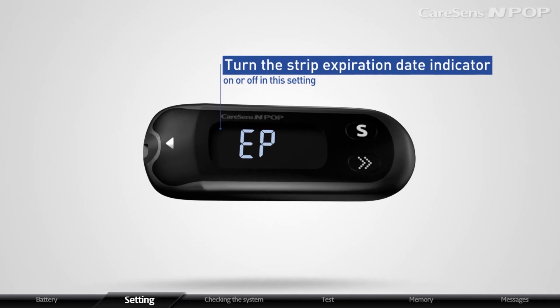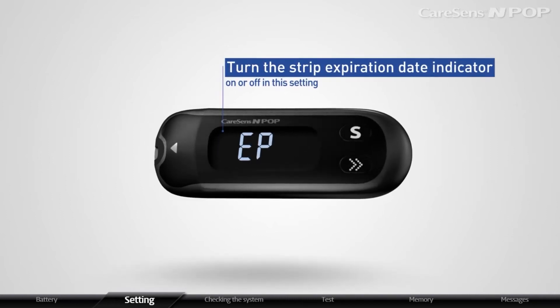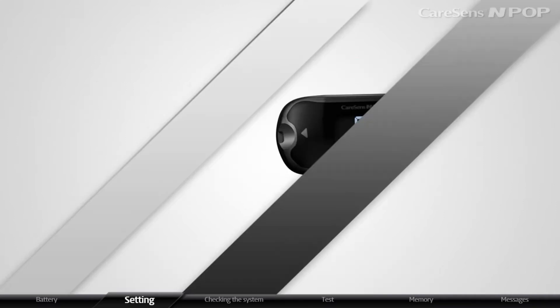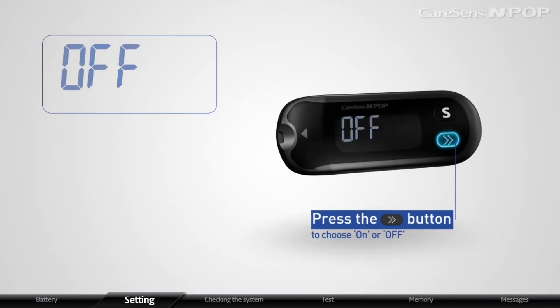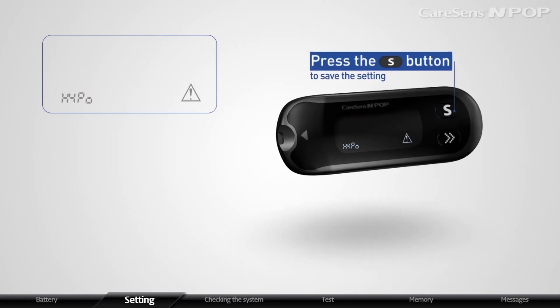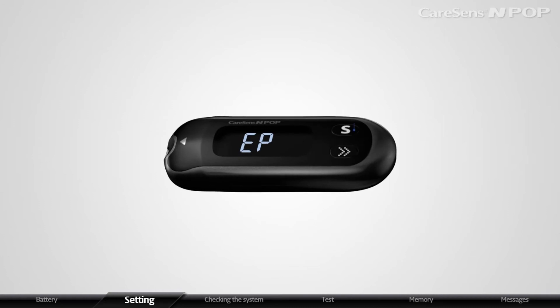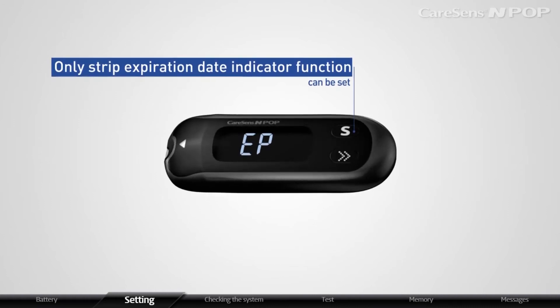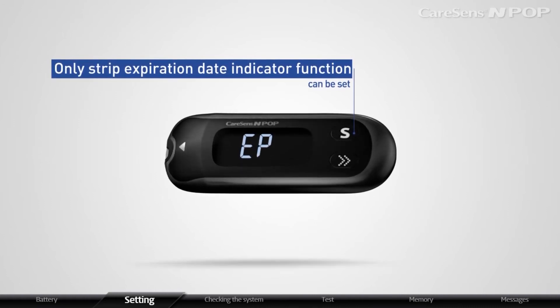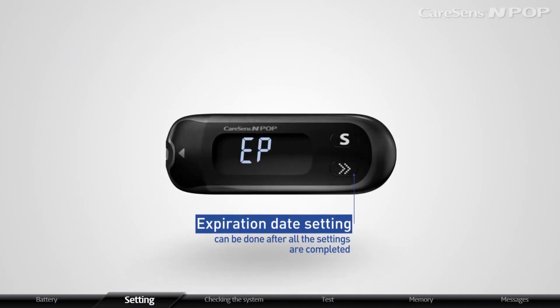CareSense InPop allows you to turn the strip expiration date indicator on or off in this setting. When EP blinks on the display, press the arrow button to choose on or off, then press the S button to save the setting. In this stage, only the strip expiration date indicator function can be set. Expiration date setting can be done after all the settings are completed.